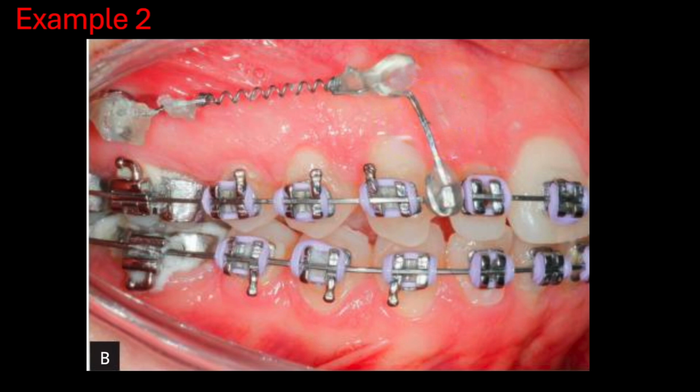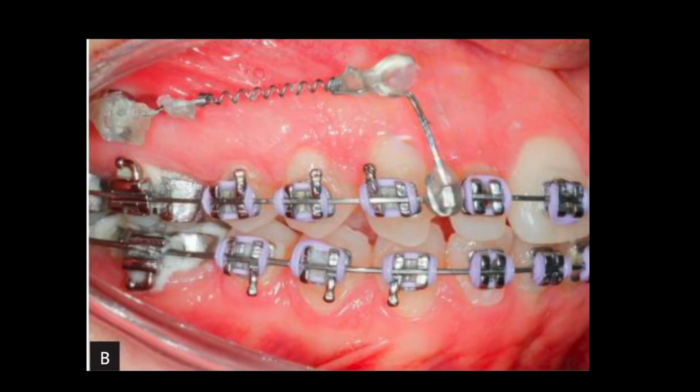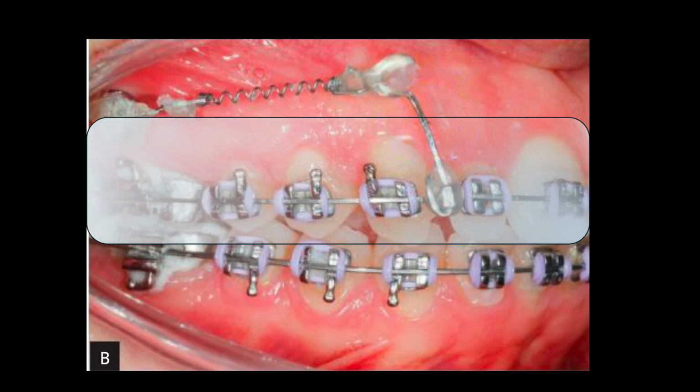Another example, in this case we do retraction using an IZC miniscrew with high placement and a full-sized archwire. How can we predict the tooth movement in the upper arch? Step 1, identify the active unit. Because the full-sized archwire goes along the anterior and posterior segments, they are connected together. So the active unit in this scenario is the total arch.